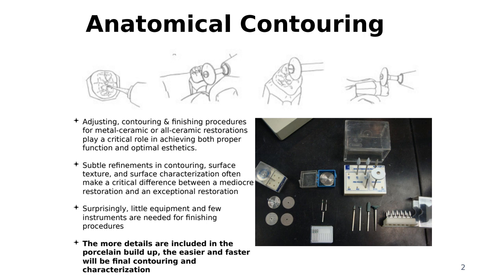Then if we do a metal substructure, we're gonna use dental alloys. We can use high noble or noble alloys. We can do base alloys, or we can do all ceramic substructure.